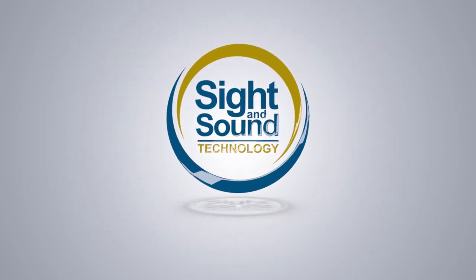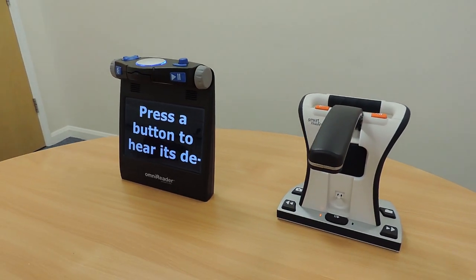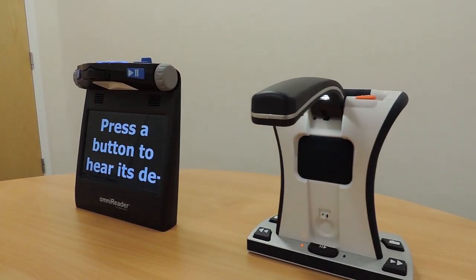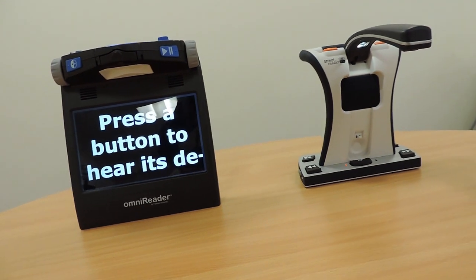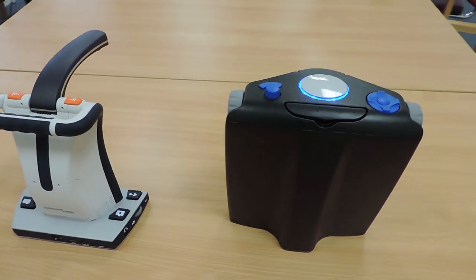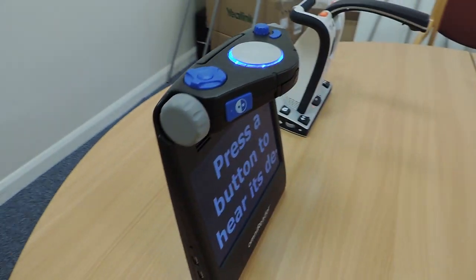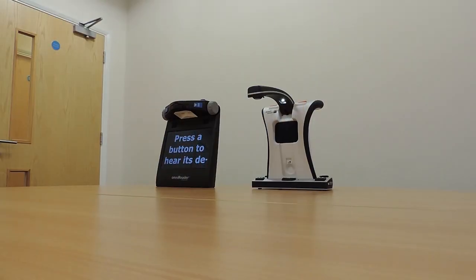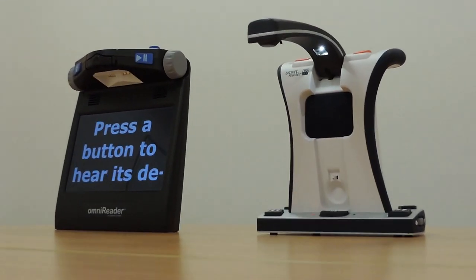Hello and welcome to this Sight and Sound Technology demonstration. Today we're going to take a look at two solutions that offer easy text reading: the Smart Reader HD by Enhanced Vision and the Omni Reader by Freedom Scientific. Both products offer the ideal solution for reading magazines, books, newspapers and other documents, and both include a built-in camera and use OCR technology to convert text into speech.